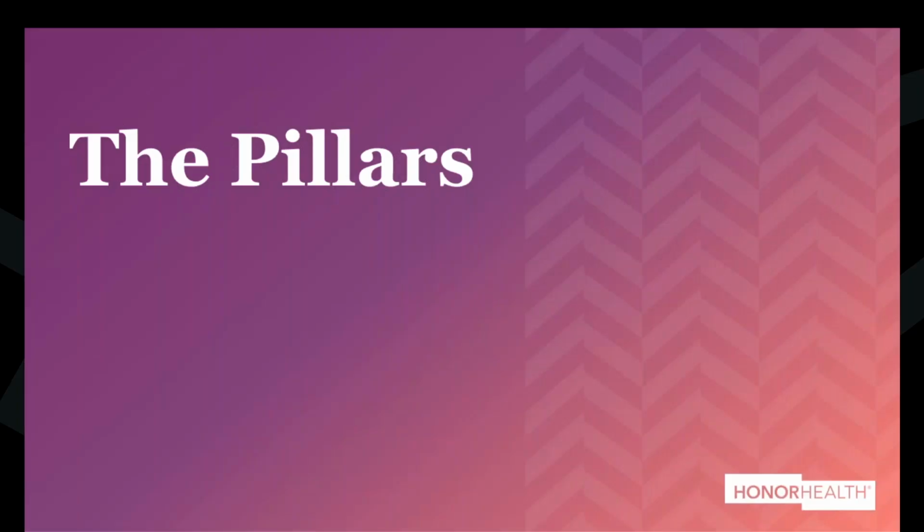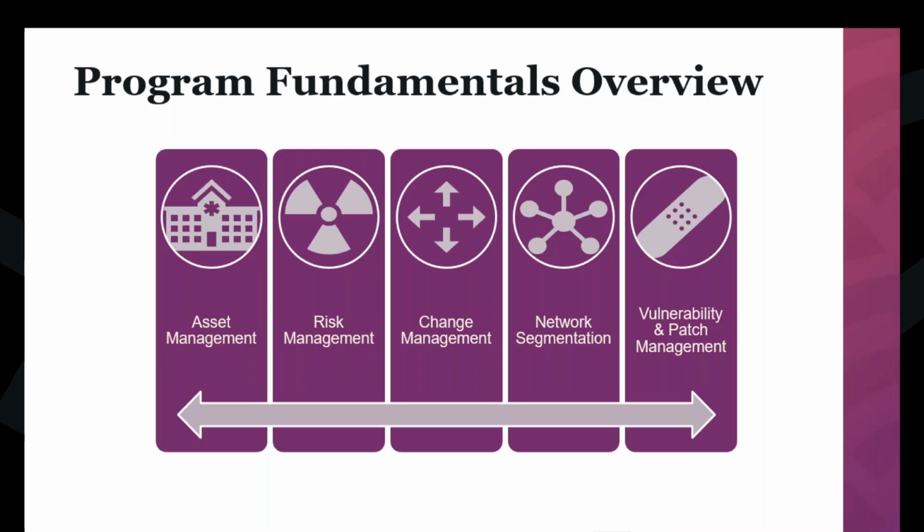Okay, we're going to talk about the pillars. These are really the foundations of a medical device security program. There's more than these 5 pillars that we'll present, but since we're talking about fundamentals, this is what I think medical device security should really focus on, at least in the beginning. So we have asset management. We discussed the need for an accurate inventory. Risk management, how do you manage that risk, right?